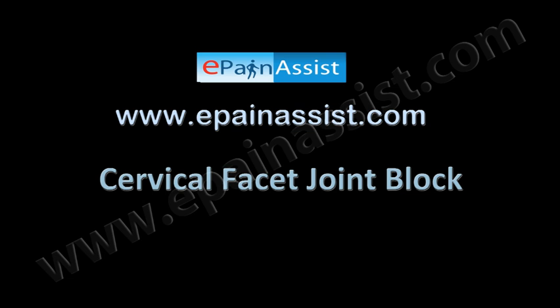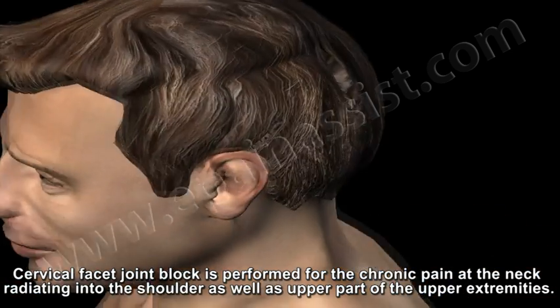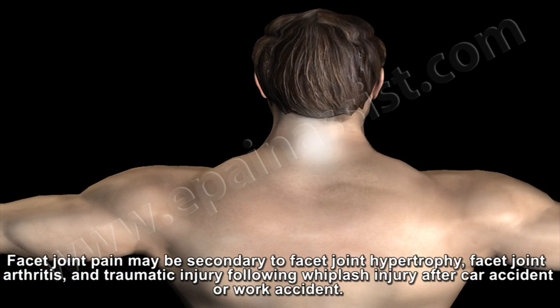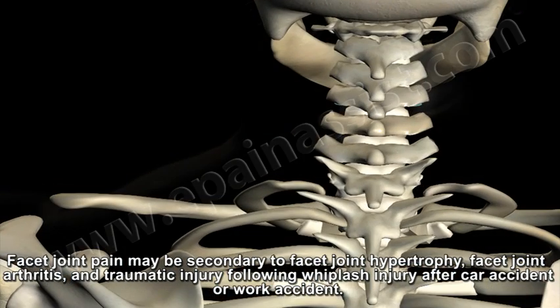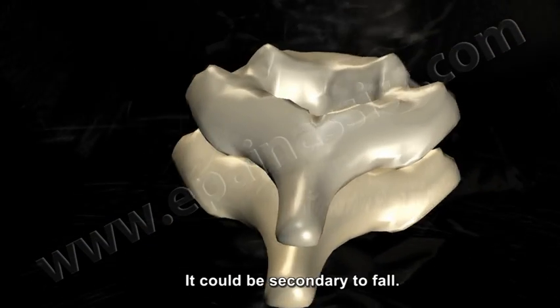Cervical Facet Joint Block. Cervical Facet Joint Block is performed for chronic pain in the neck radiating into the shoulder as well as the upper part of the upper extremities. Facet joint pain may be secondary to facet joint hypertrophy, facet joint arthritis, or traumatic injury following whiplash injuries after an auto accident or work accident. It could be secondary to a fall.